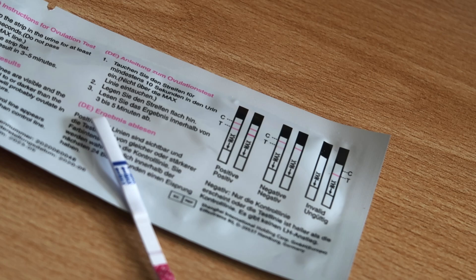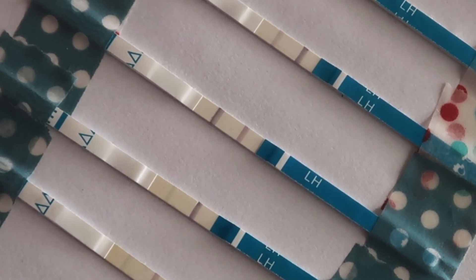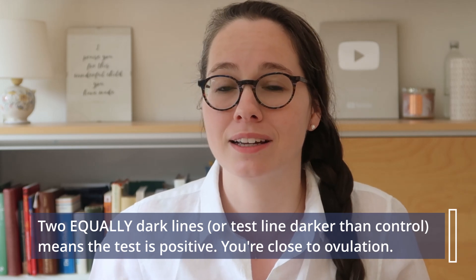You will have two lines if you are getting close to ovulation. You have the control line on the right, and on the left another line will show up if LH is detected in your urine at all. If it is lighter than the control line, that test is negative — it does mean LH is in your urine, so something is happening, but as long as the test line and the control line are not equally dark, it's not positive. As soon as you have two equally dark lines, or your test line is darker, that means the test is positive.